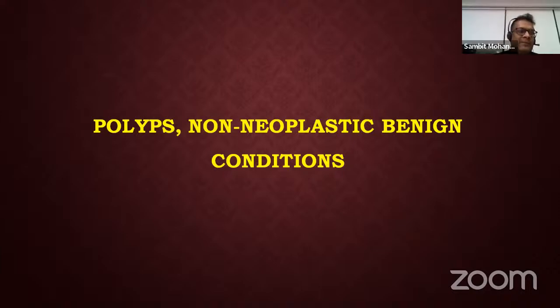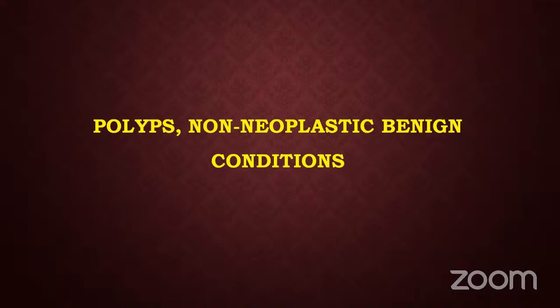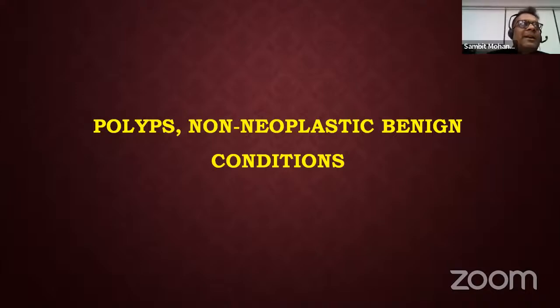The thing is, it was a known case of follicular thyroid carcinoma, and there was a bladder nodule. The patient presented with hematuria, so they worked it up. We had the history of follicular carcinoma when we received the TURBT chips. It was quite scary, actually. We had the history, so that made our life very easy, because we had the history of follicular thyroid carcinoma in that patient, followed by these nodules on the urothelial mucosa.